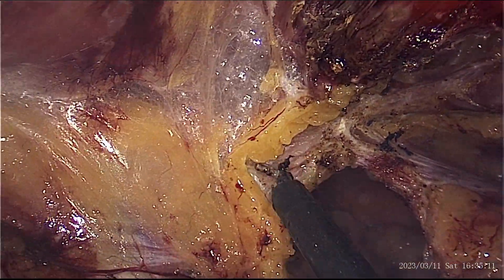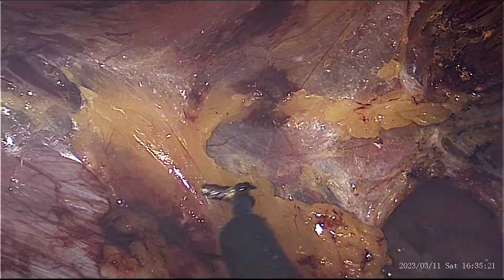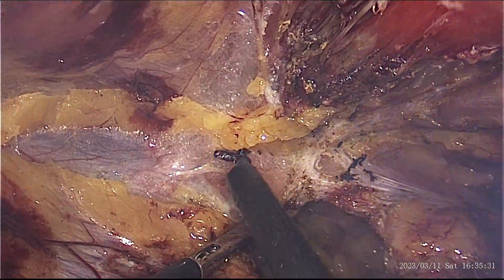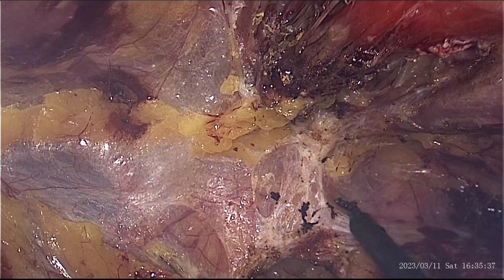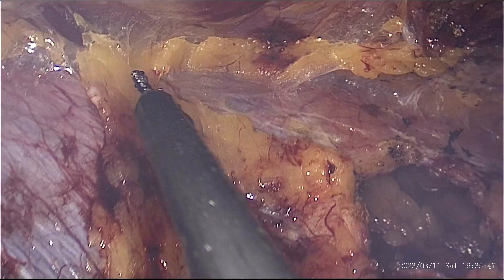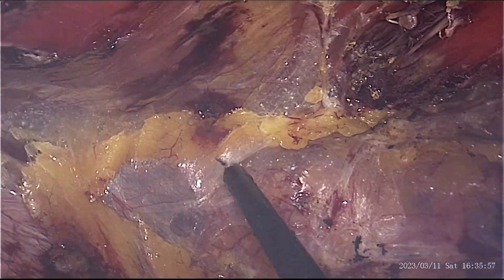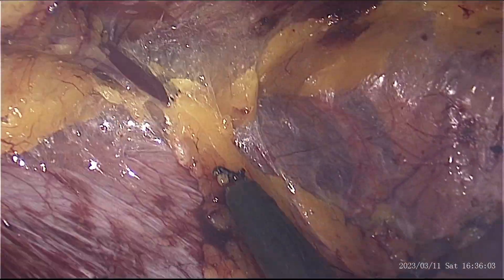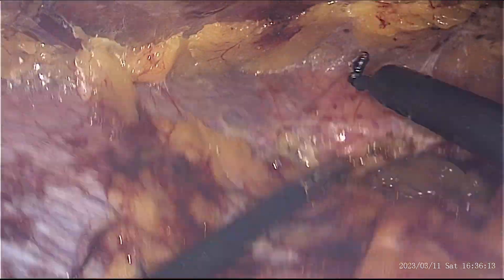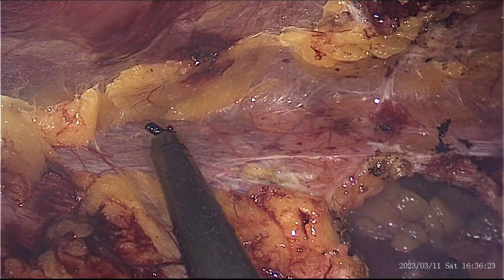Once the flap is dissected from the hernia, further dissection proceeds inferiorly below the arcuate line. The arcuate line can be well appreciated here. Dissection proceeds further between the two layers of fascia transversalis, as you can clearly see — one is a very bright yellow colour on the roof, and below is the slightly orange flap in the midline, with thin peritoneum on both the lateral edges of the flap.